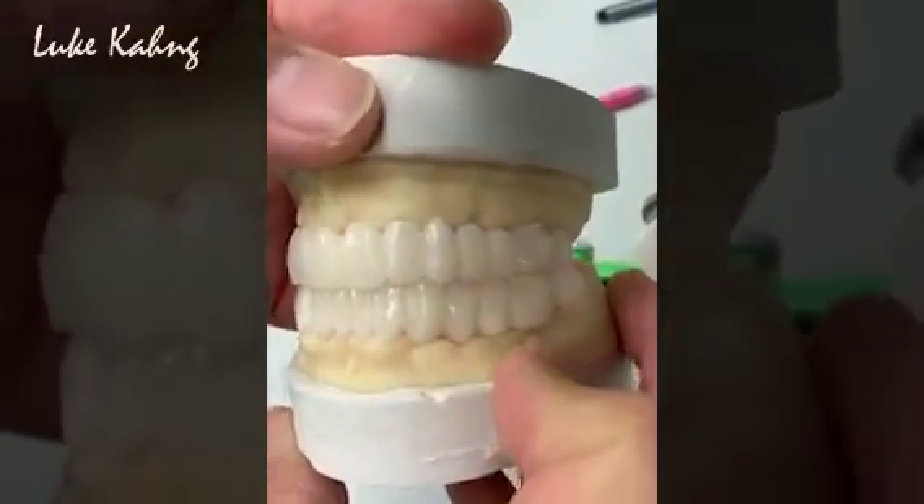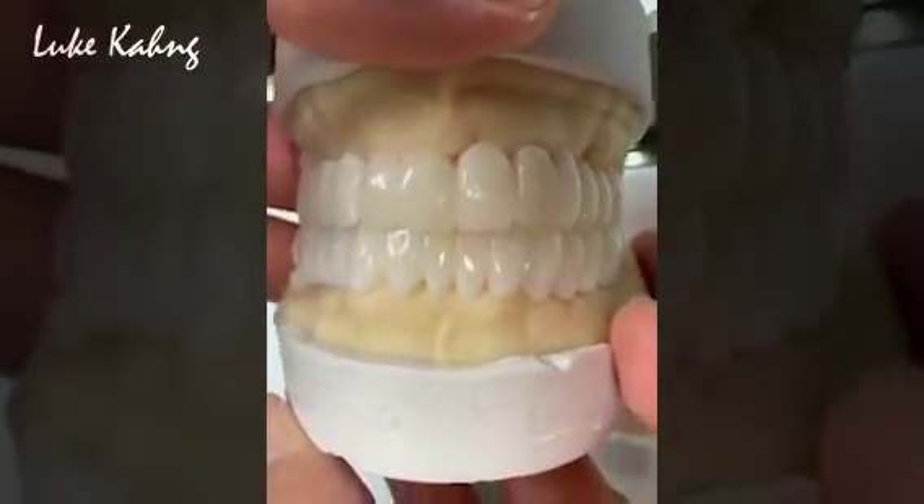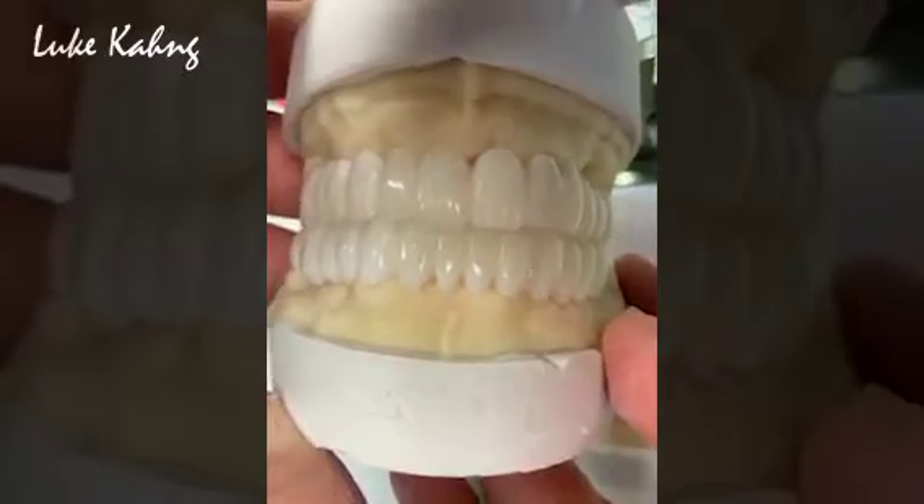We made all acrylic and finished it. Now sending it to Florida — Dr. Sapirong.